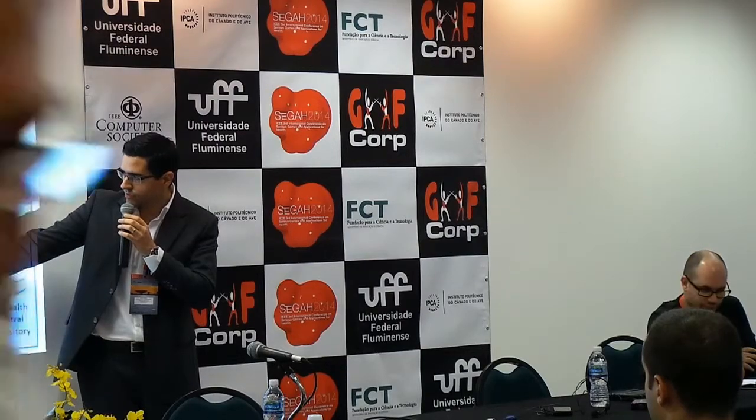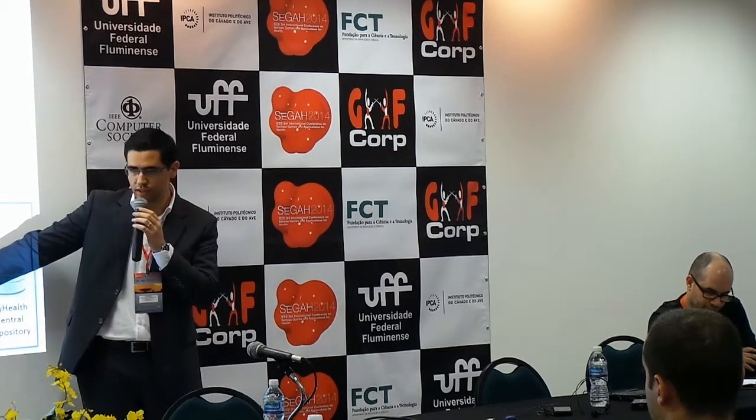So you have the same system and you can have a device in the middle, which is maybe a smartphone. This smartphone is able to actually visualize your signals and also to route your data to other systems, like, for example, a central repository. The idea of this approach is that either this can be a personal device where the subject, the user, can actually monitor his EEG.